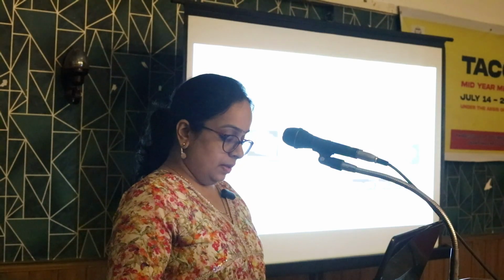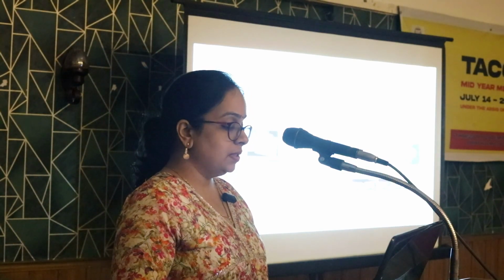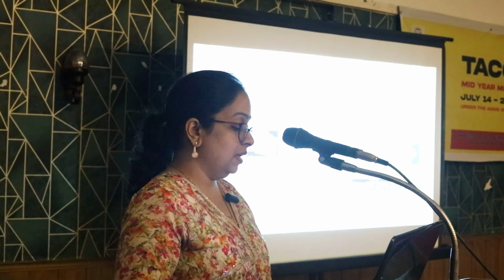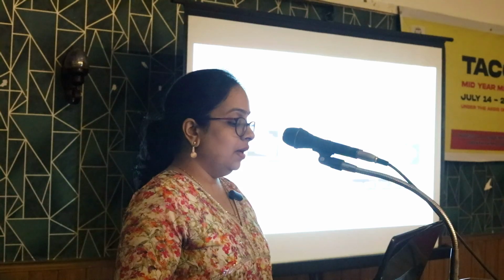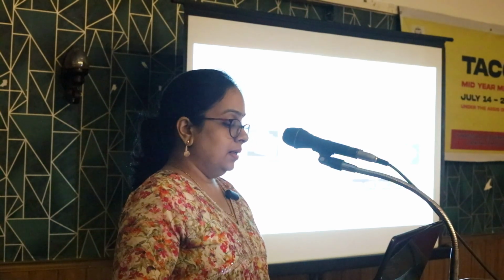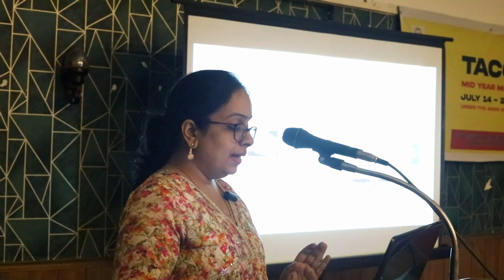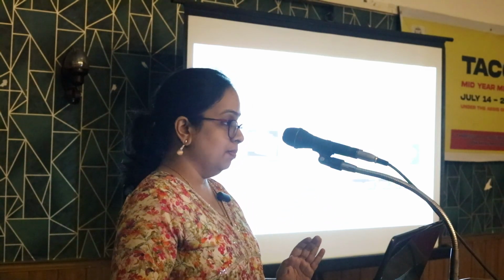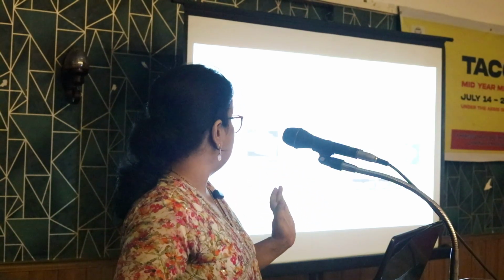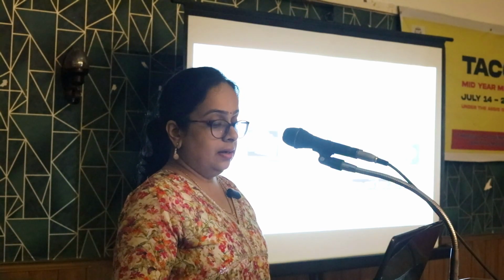So, it's important to note the direction of the fibers. This is the direction of the fibers. So, if you note any thinning of the retinal nerve fiber layer in the inferior part, there can be thinning of the ganglion cell layer mainly in the inferior or inferonasal part. So, the direction of the retinal nerve fiber layer is important. The anatomical direction and anatomical location are important. Similarly, in this case, this is the direction of the fibers.